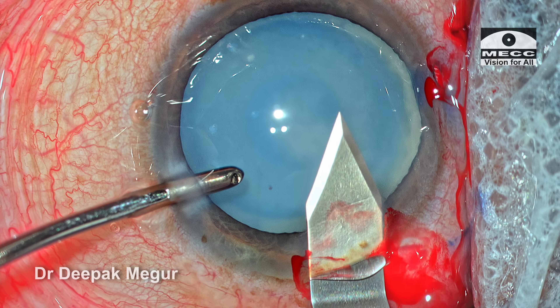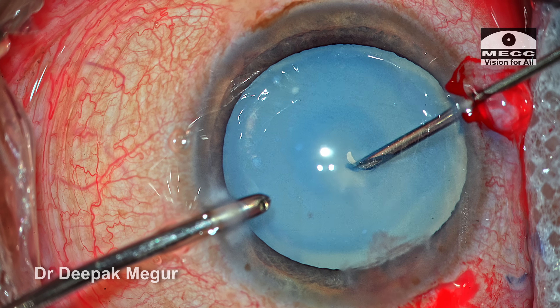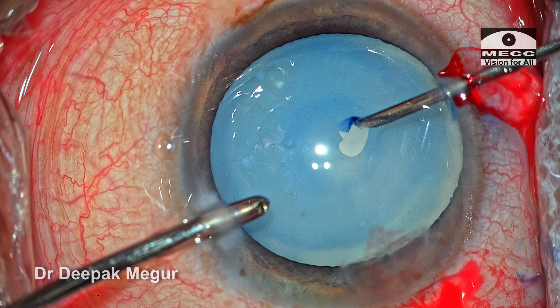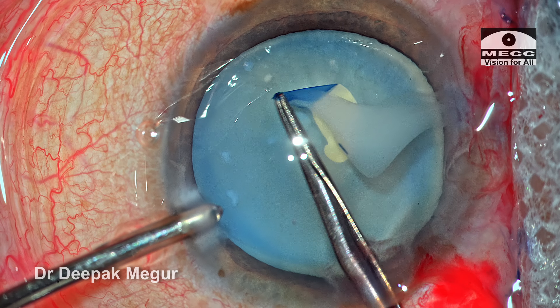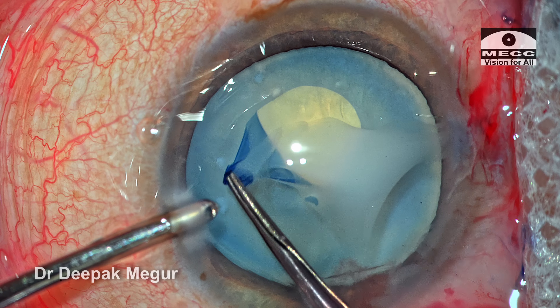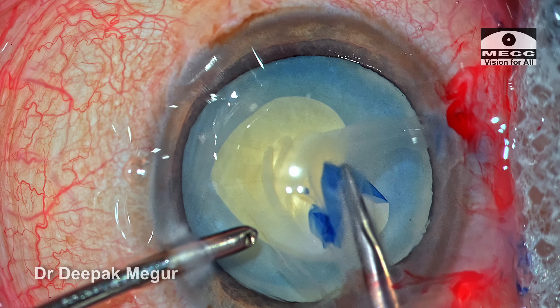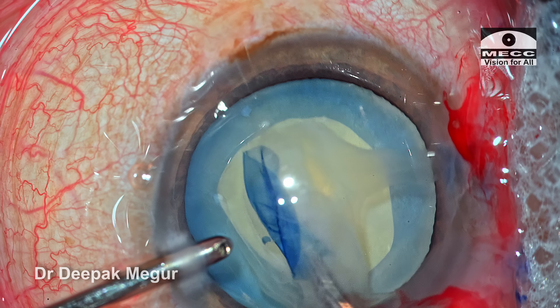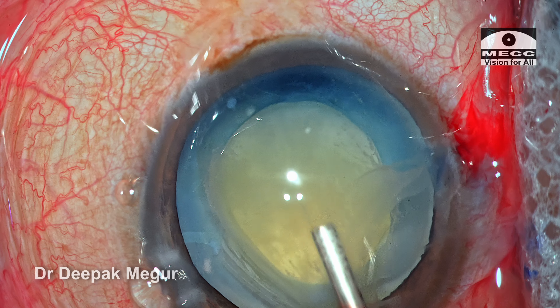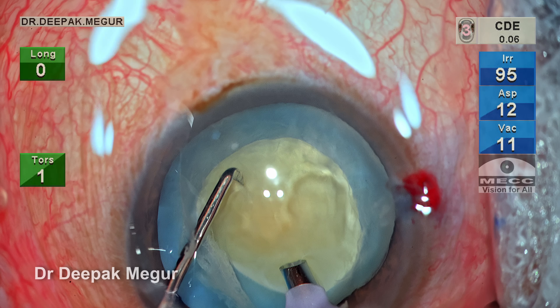The tunnel is slightly longer than I would have liked, but it's all right. As soon as I puncture the capsule, as expected the liquefied cortex flows up. Once the flap is raised, I always prefer to use forceps to perform the rhexis — the Haldipurkar rhexis forceps — and a properly sized rhexis is created. The superficial epinucleus and cortex are already removed.